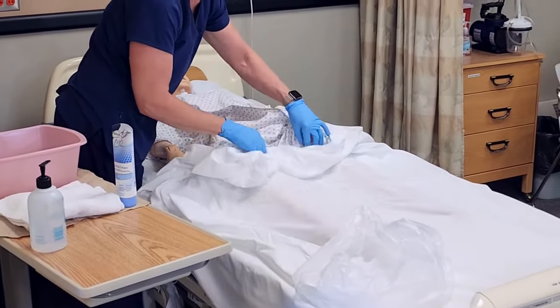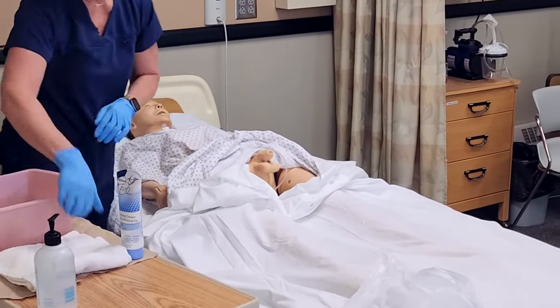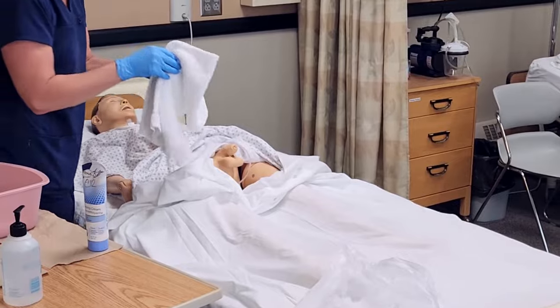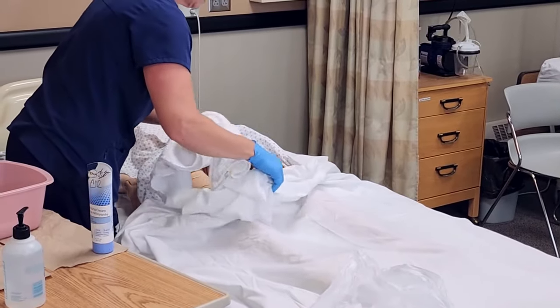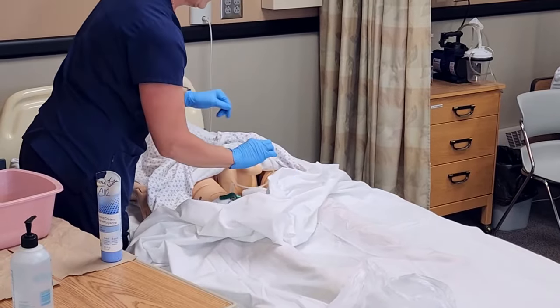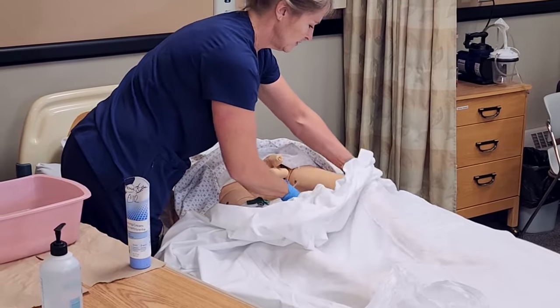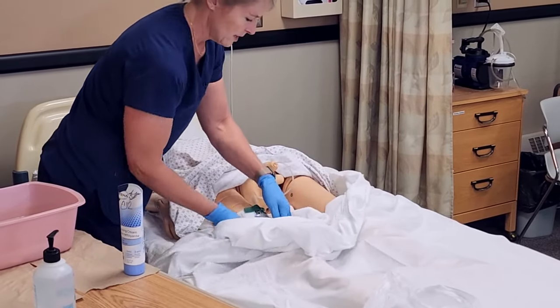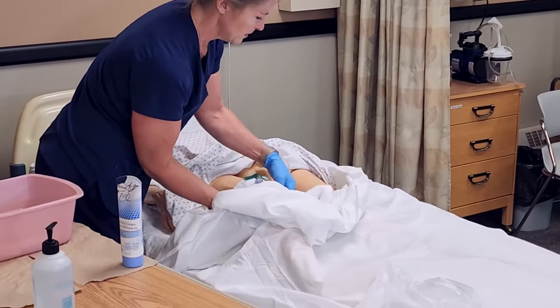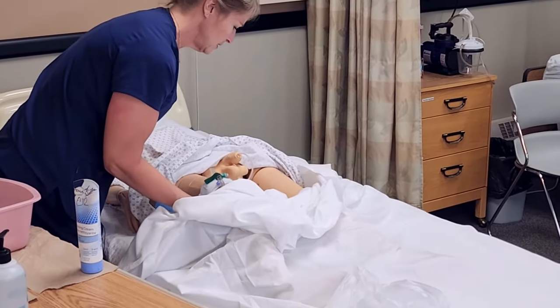We could put a blanket over the top of him and then, just like peri care, we'll put a towel down underneath. We want to be very careful that we're not on top of the catheter tubing — any time that tubing gets tugged it's very uncomfortable for the resident. So if he can lift his hips we'll ask him to, otherwise we'll lift behind his knees and get the towel down.